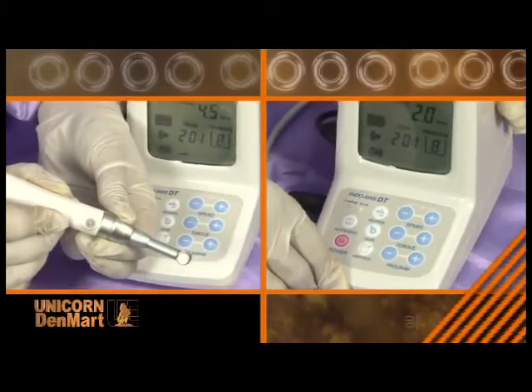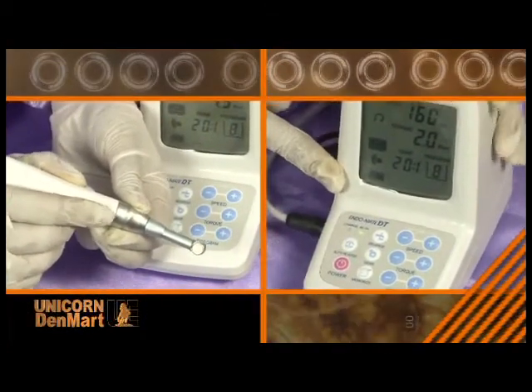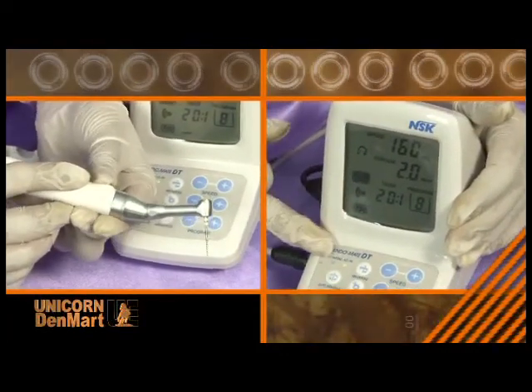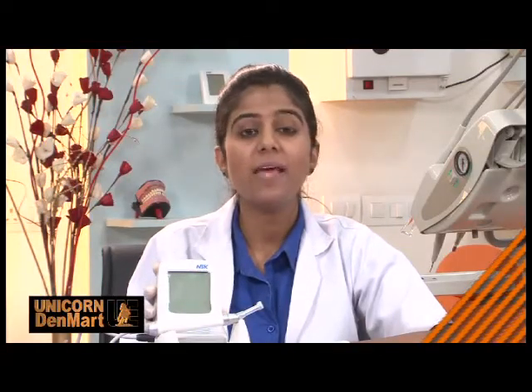Adaptive torque control senses the gear ratio of the head selected and adjusts performance instantly to complement your cutting technique for maximum efficiency. Endomate DT is electrically operated, lightweight, and compact, providing high performance assistance to the user at all times.